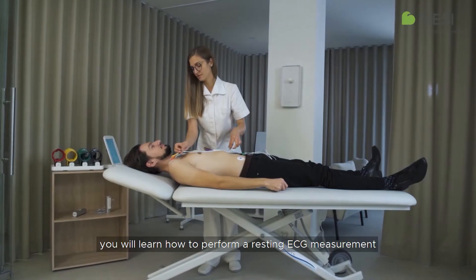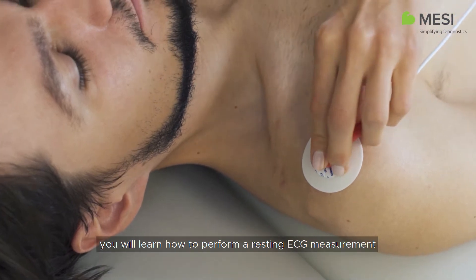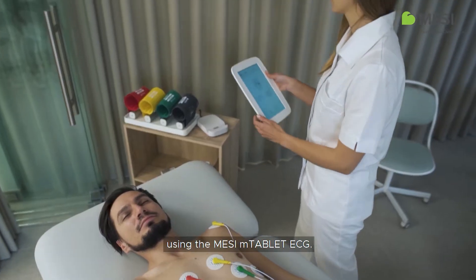In the following video, you will learn how to perform a resting ECG measurement using the MESI mTABLET ECG.